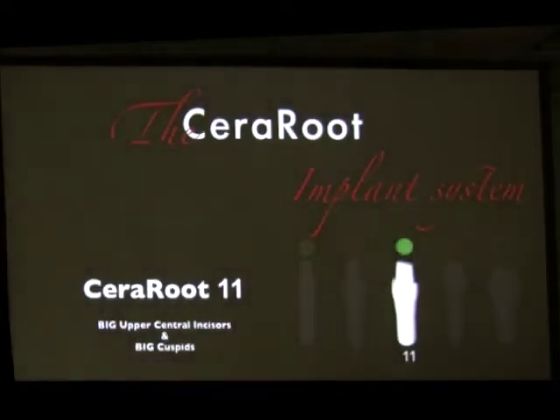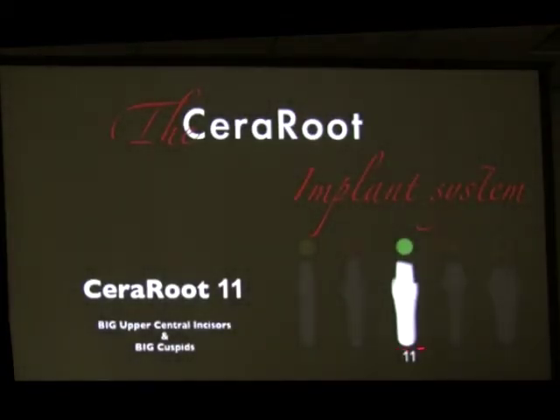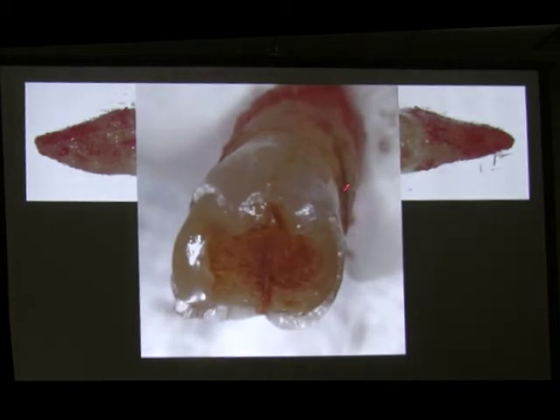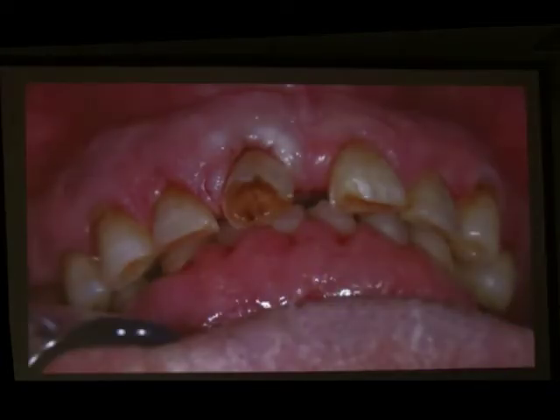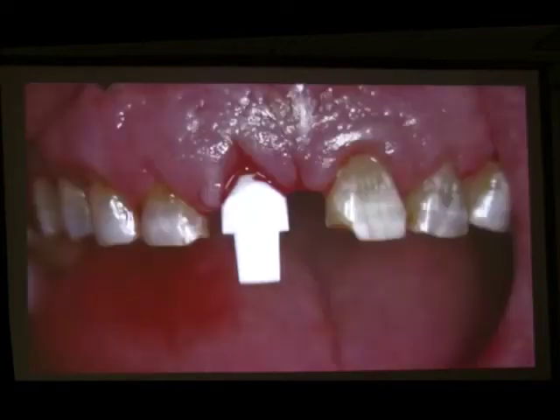So this is the big central incisor implant. It's a huge central. It's the stronger. It's the mechanical testing that I was showing you before. So patients that are able to fracture their own teeth in half, not just horizontally but also vertically. Patients that are this much destroyers, if you don't use a powerful implant, they will fracture. If you put the crown in occlusion, they will fracture narrow implants. So patients that fracture their own teeth, please use the biggest implants that you can.